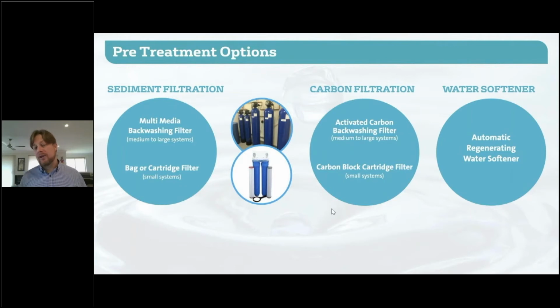And then you may have, depending on the feed water quality, a requirement for a water softener before the RO as well, to remove hardness minerals being calcium, magnesium, iron, and manganese. And basically, again, to help look after the RO unit. Now, as we mentioned in that table 7.2.3.1, you may need a softener to treat all your water for your CSSD.